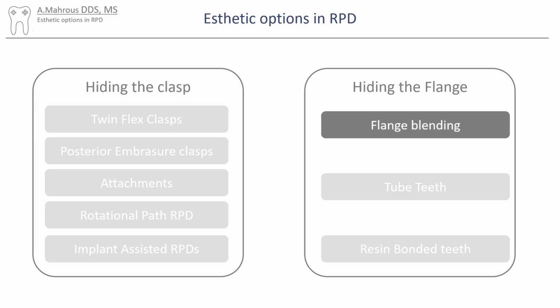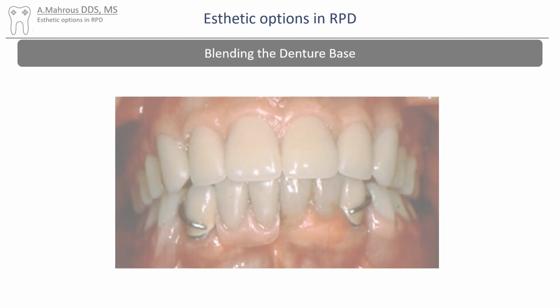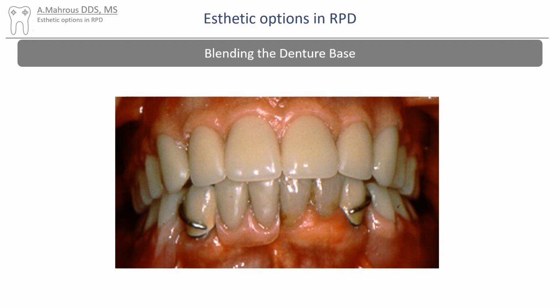Starting with flange blending. In this case here, you can see a flange on the bottom that's not blended at all, and that's obviously very unaesthetic. On the contrary, in this image here on the top, this flange is barely noticeable. That's because it was very well polished and blended.